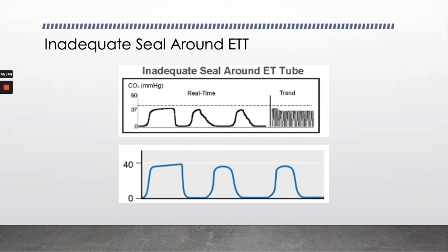with a little bit of air, and you can check and see if with your next ventilation, it resumes back to a normal capnograph. If it doesn't, then you may have to remove the ET tube and re-intubate the patient just to ensure that your cuff has an adequate seal, because the cuff could be leaking for a number of reasons.